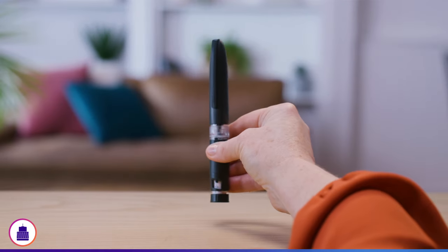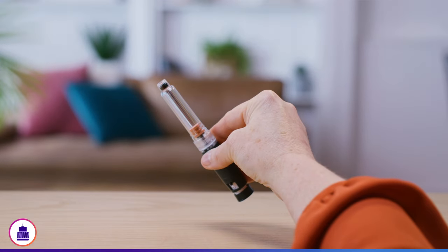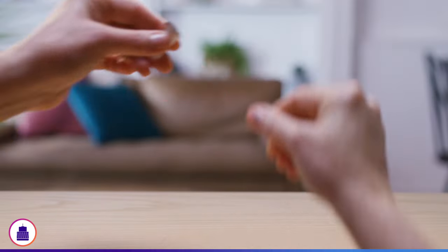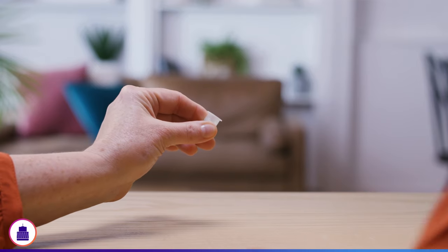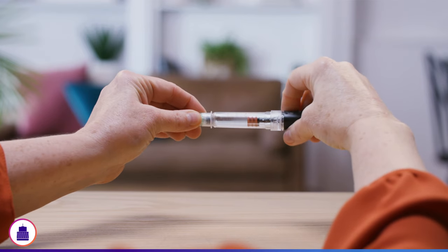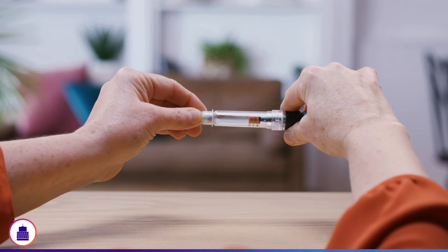To attach a new pen needle, start by pulling the cap off the pen and setting it aside. Wipe the rubber seal at the end of the pen with an alcohol swab. Pull the peel tab off the pen needle. Hold the pen horizontally and attach the pen needle straight onto the end of the pen and screw on tight. Once you feel a little resistance, stop twisting. There is no need to over-tighten.